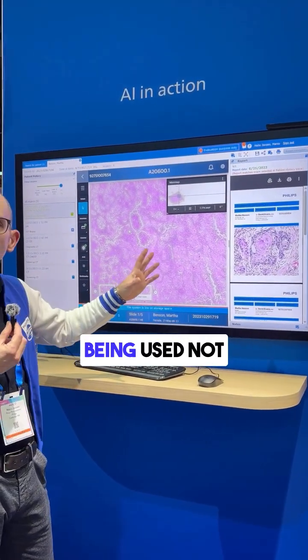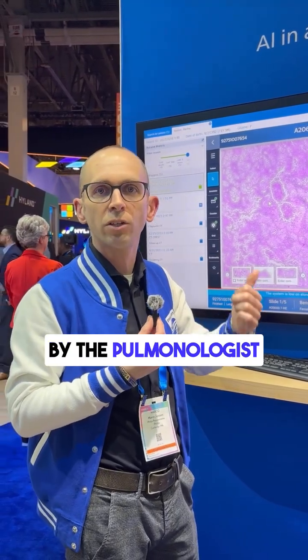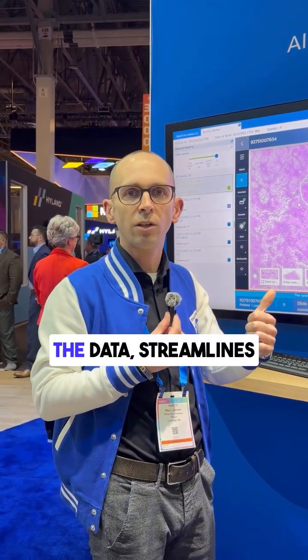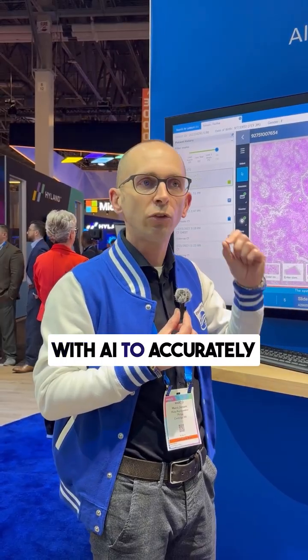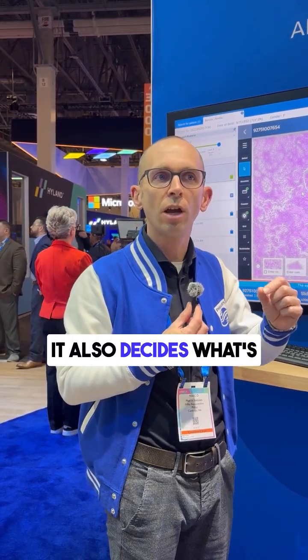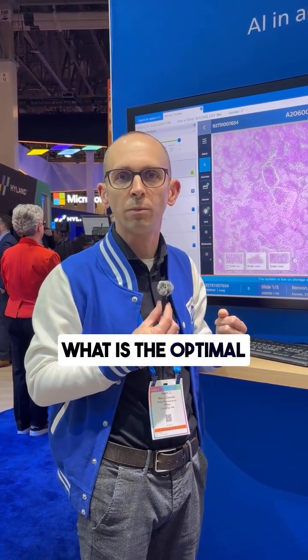And this is really being used not only by the radiologist and the pathologist, also by the pulmonologist and the oncologist. So Philips Integrated Diagnostics unifies the data, streamlines the workflow, and scales the insights with AI to accurately and timely diagnose, but also decide what's the next step in line for this patient's care journey, what is the optimal treatment.